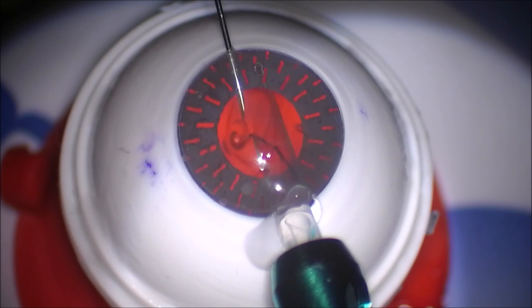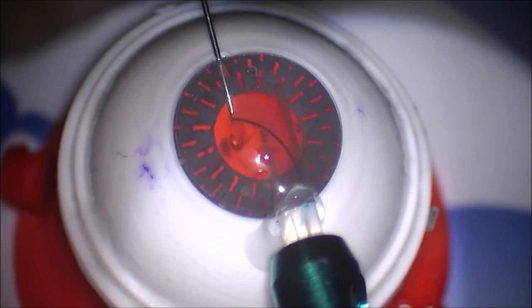And then I'm flattening out. You see how I'm turning the needle counterclockwise. And as I do that, it comes out flat. The technician advances the lens and the leading haptic goes into the bevel of the needle.